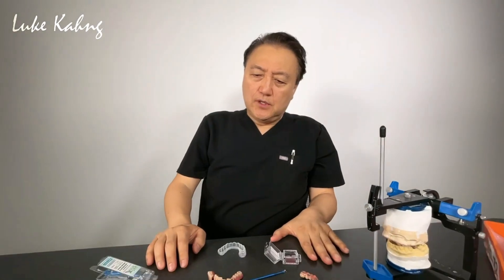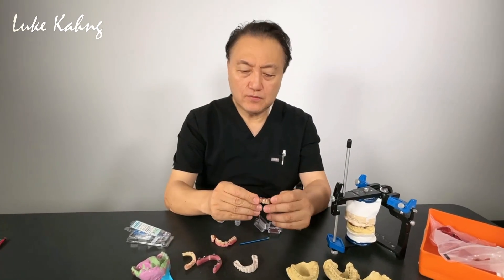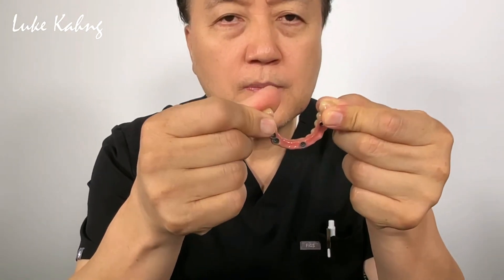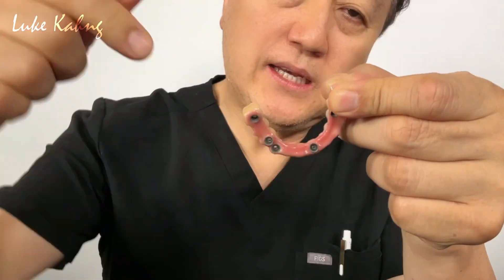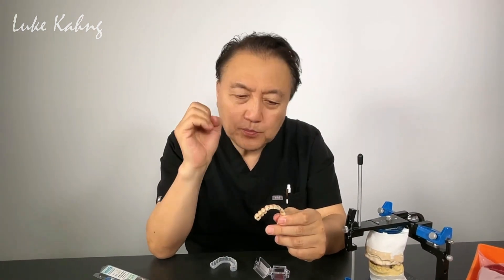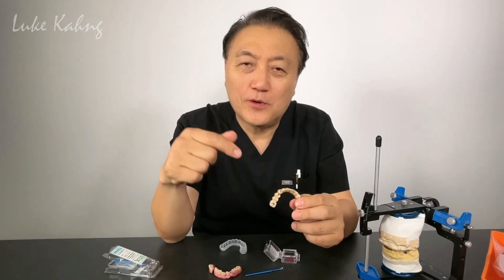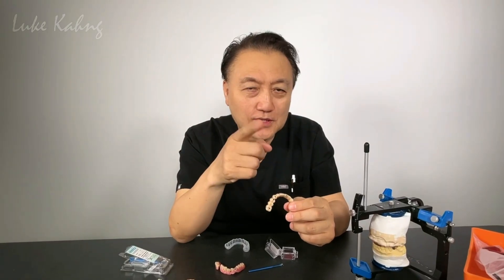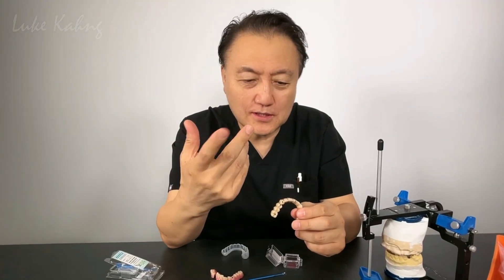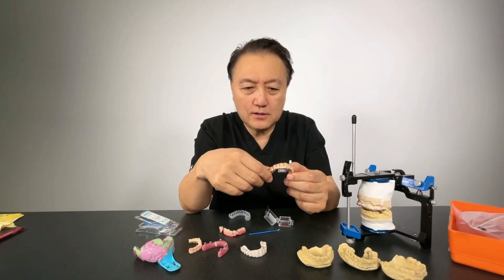This patient had a little bit of overbite/overjet, so we tried to bring it in — that's why the implant access hole is more facial. We diagnosed this a long time ago, and this case looks like it took about six months. Finally we made a beautiful thin restoration, trying to maximize hygiene. When they bite together, the tooth has the same movement. People kept asking why I don't build porcelain directly — when you're biting, it chips easily.